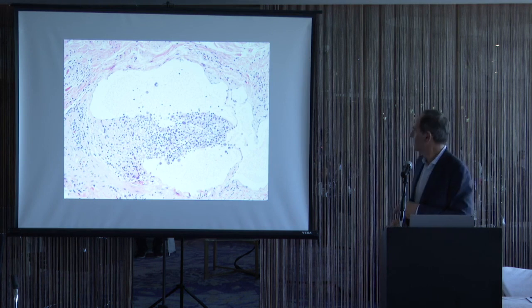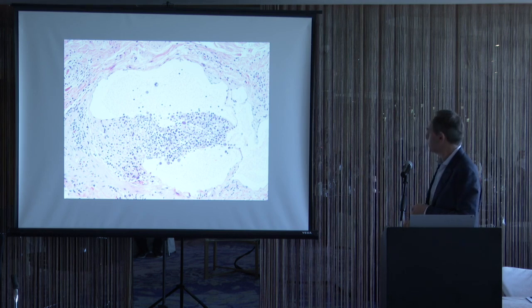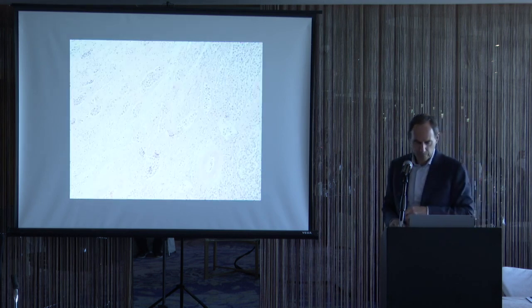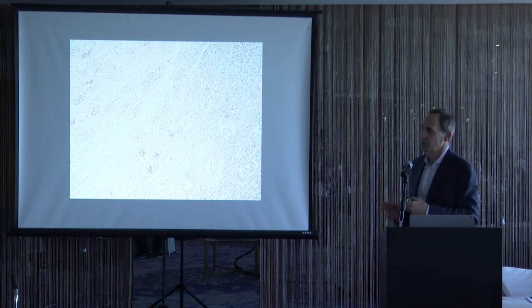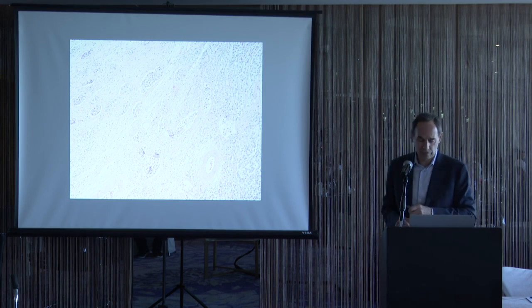Here's another case of true vascular invasion. It's attached to the wall, and you can see even at low power these seminoma cells there. Now here's a case where there's extensive tumor in spaces that conform to the shape of lymphatic spaces. This is the invasive tumor that has a different architecture. So the invasive tumor is not composed of these rounded nests. So the fact that we see these rounded nests within spaces also indicates that this is true vascular invasion in a seminoma.